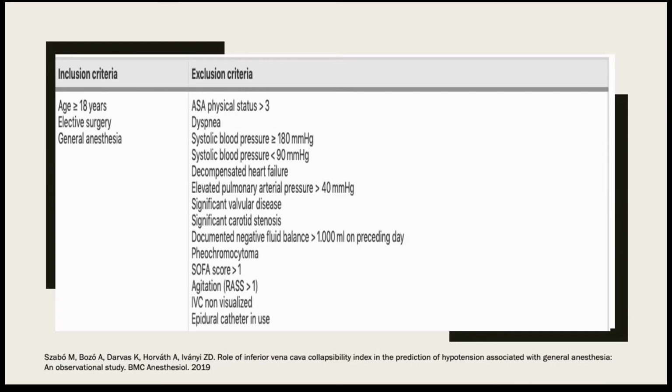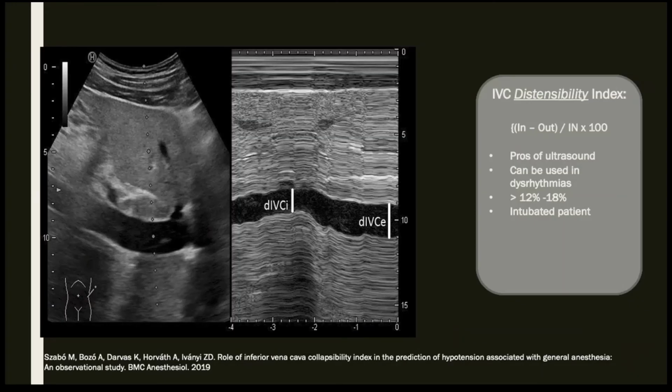Because you only look at the ultrasound of the IVC, except I see the one Priya used was on probably such good views because it's on a volunteer, but it's difficult in a sick patient. So there's the distensibility index, the same concept. It's just that when you're spontaneously breathing versus when you are pushing air into you, there's a difference, and there's no standardization for if you use positive pressure or positive end expiratory pressure either.